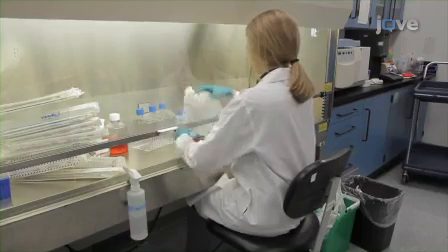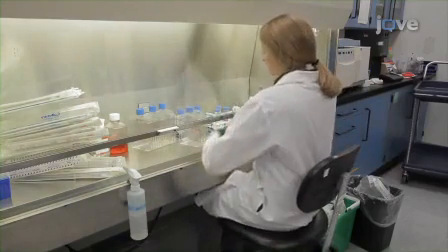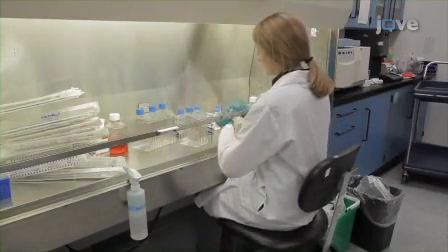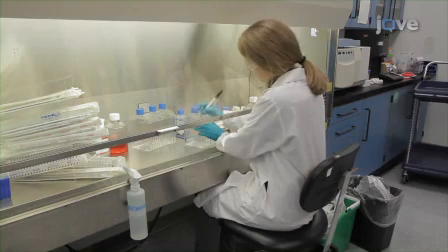To use a multi-flask for cell culture, begin by placing the vessel vertically on its side in a sterile laminar flow hood with the cap end facing up. Label the multi-flask while it is in this position before any contents have been added.